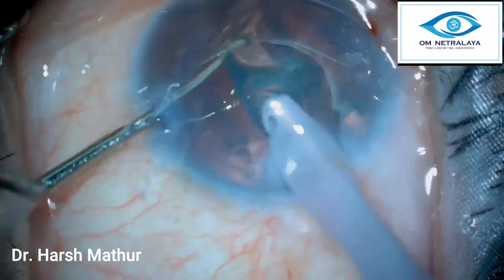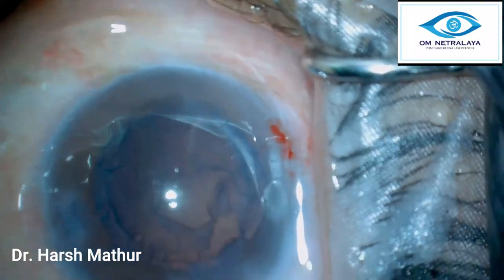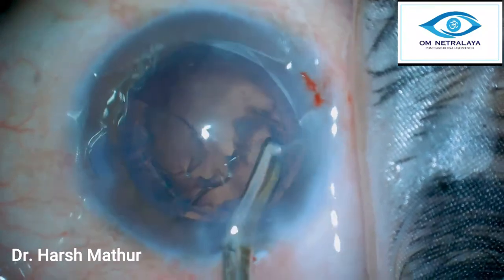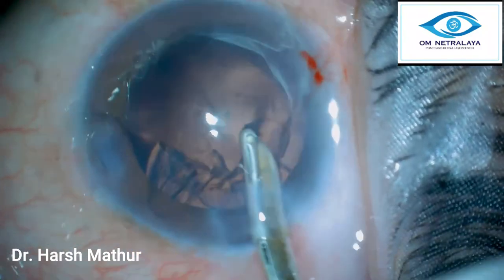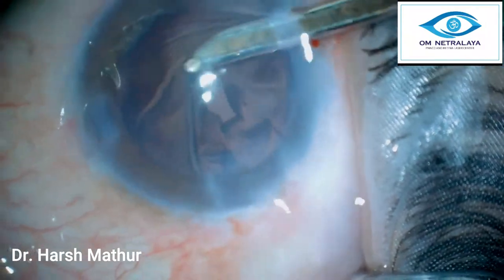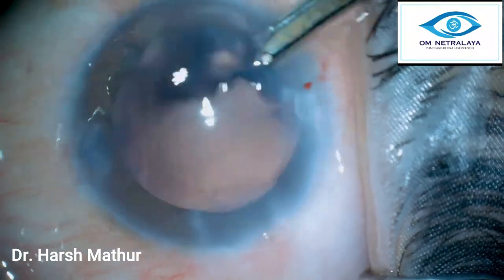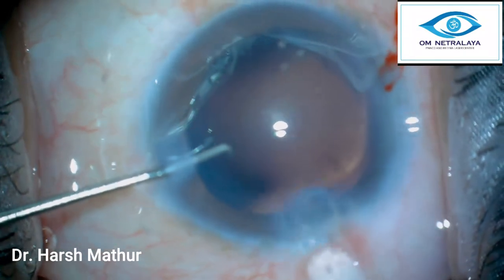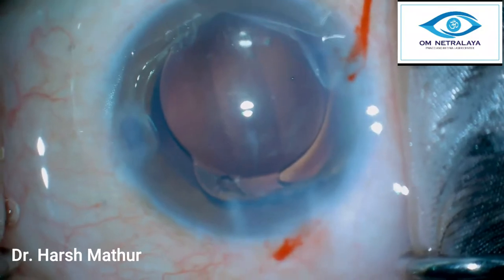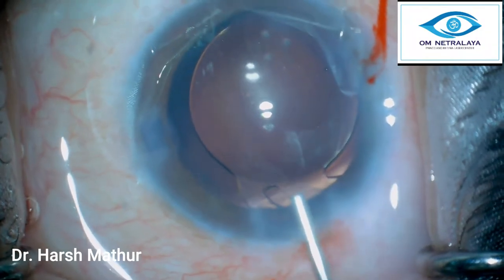The parameters are reduced and the epinucleus is also emulsified. Now is the time to clean the cortex with a 22-gauge Simcoe cannula. The video has been sped up to two times normal speed. To clean the 12 o'clock cortex, it is better to go through the side port. Now the IOL is placed — the leading haptic goes in the back and the trailing haptic is then gently dialed in.